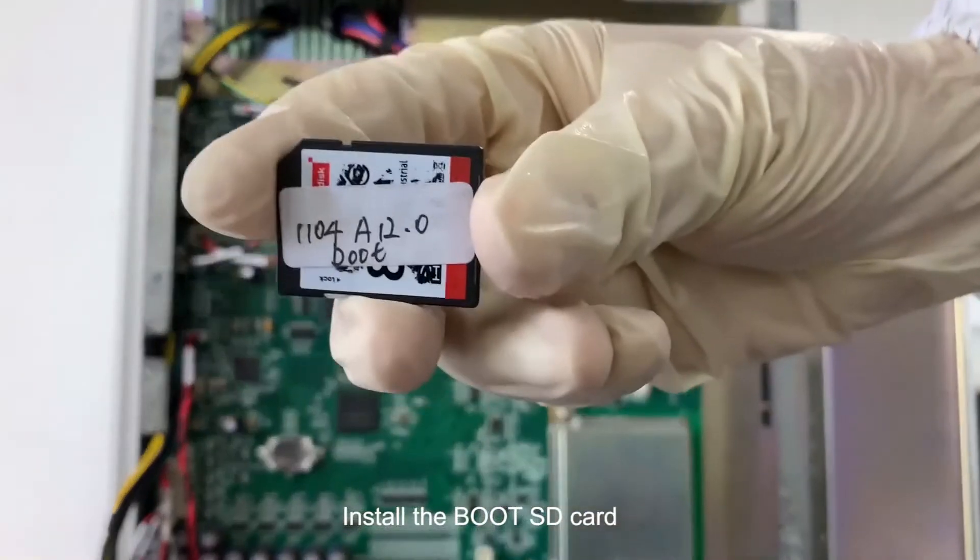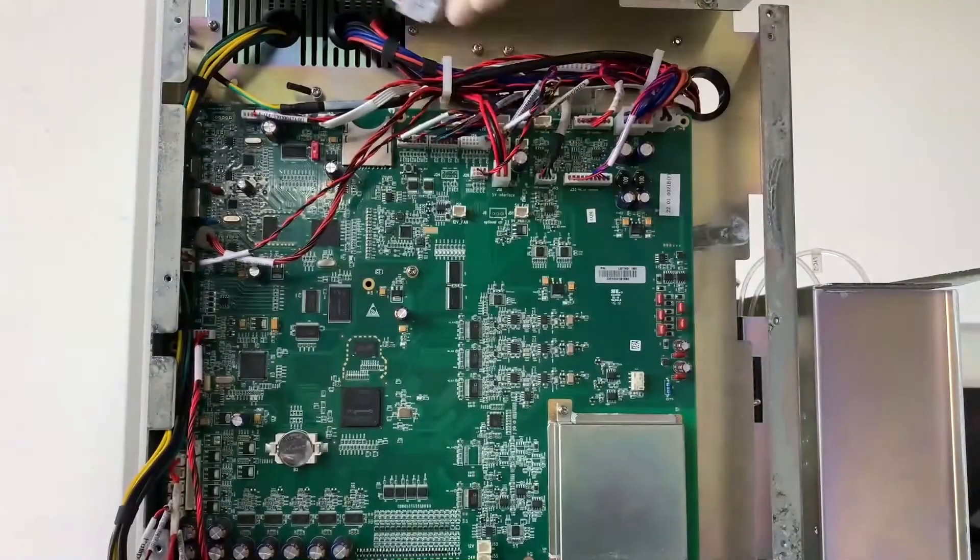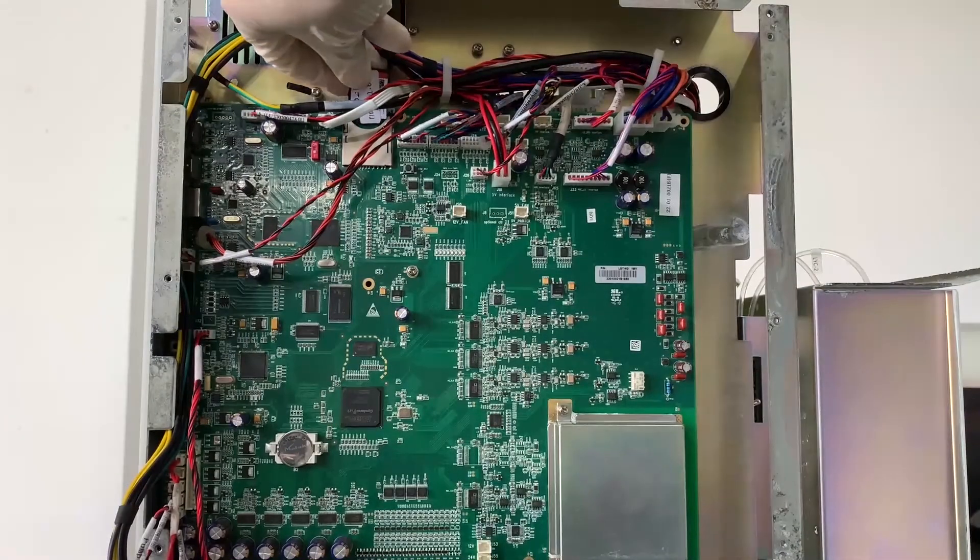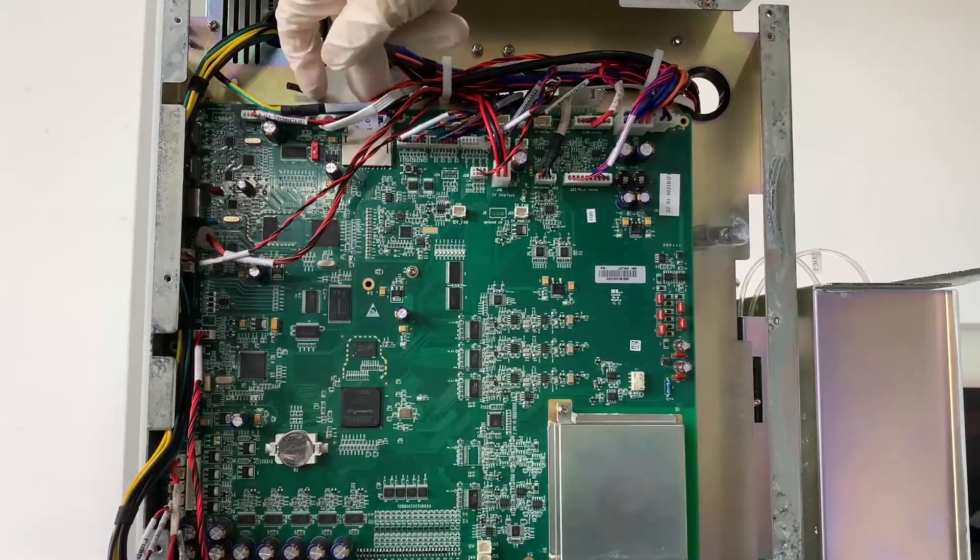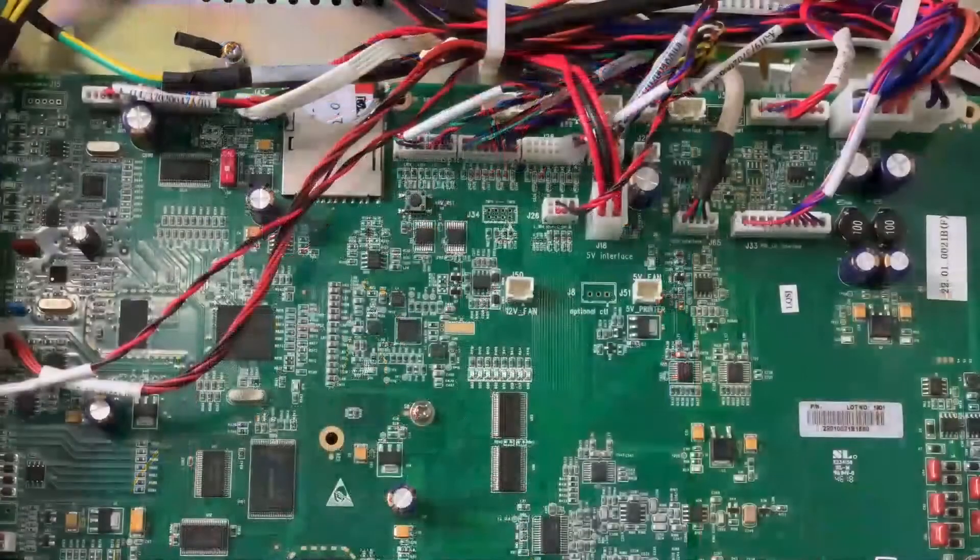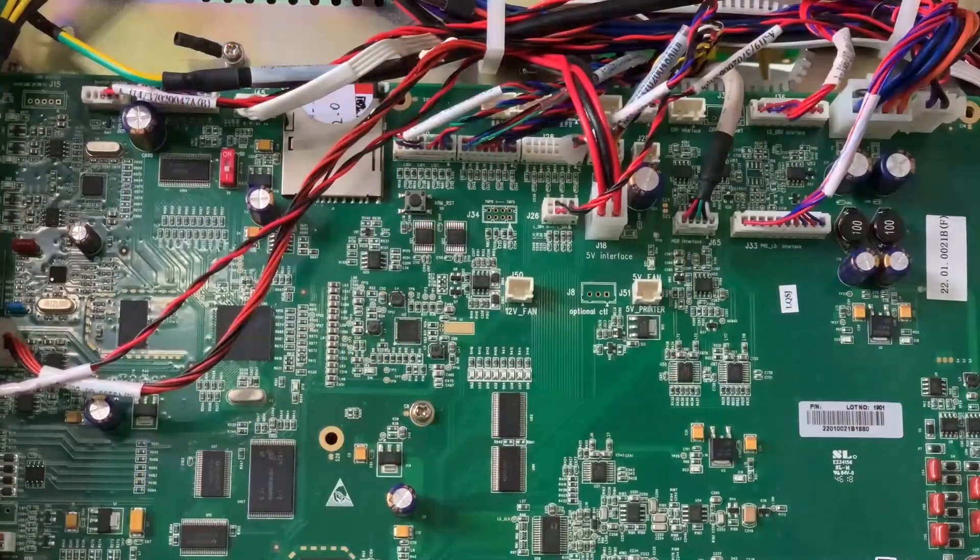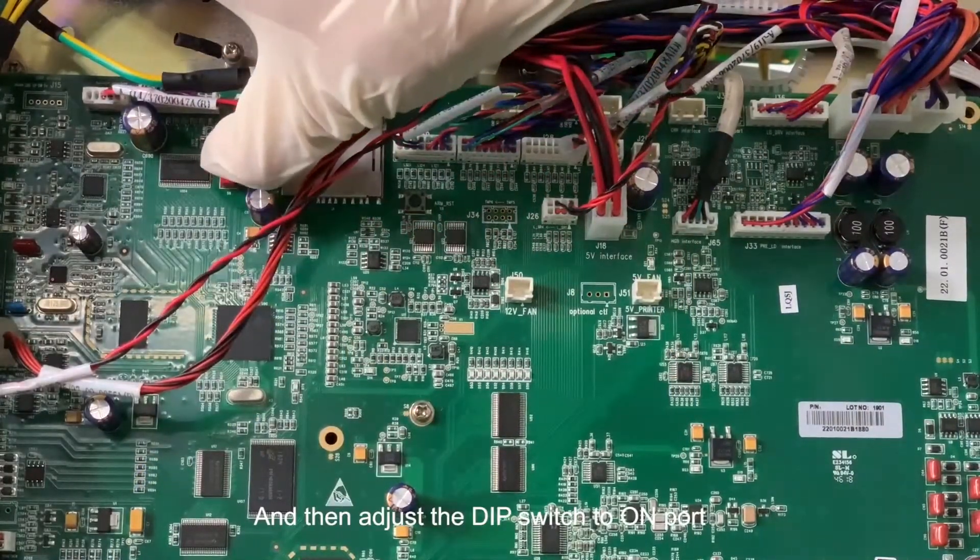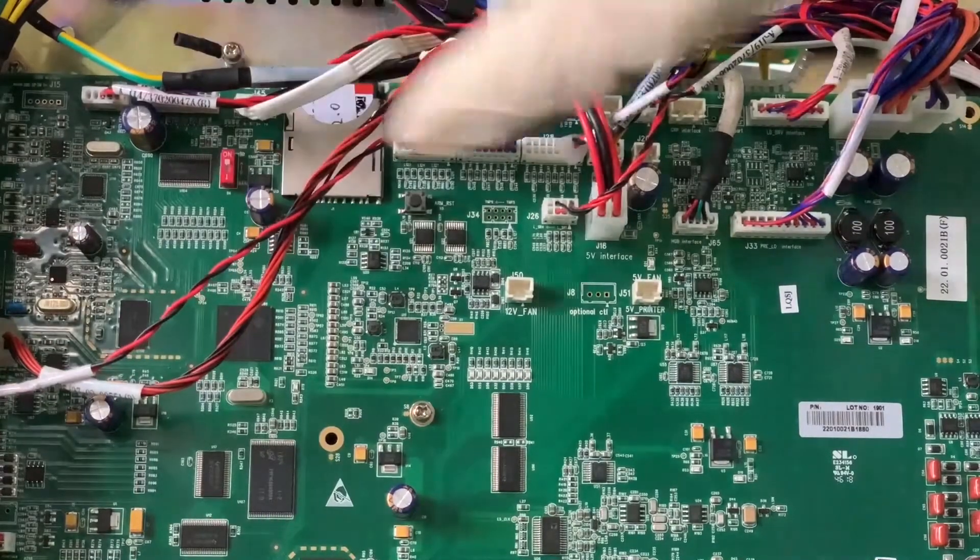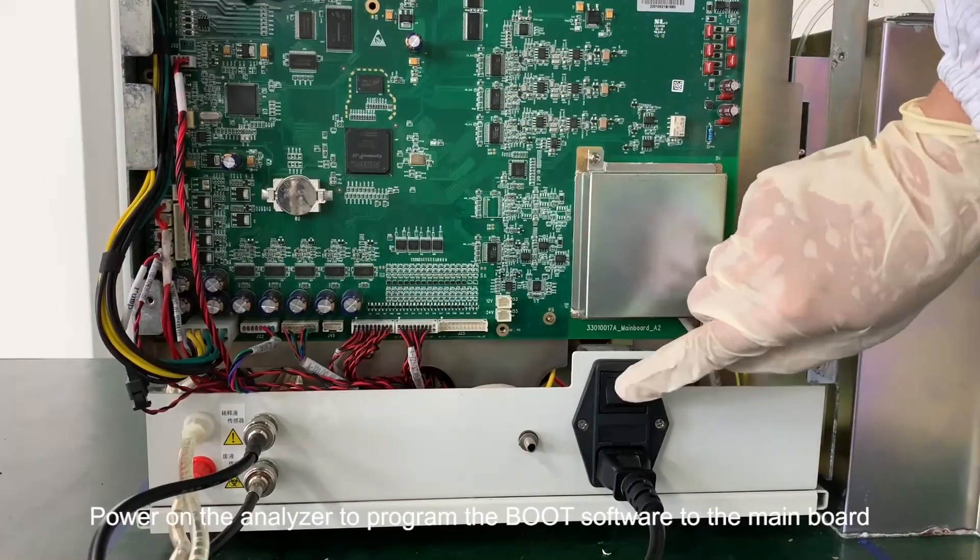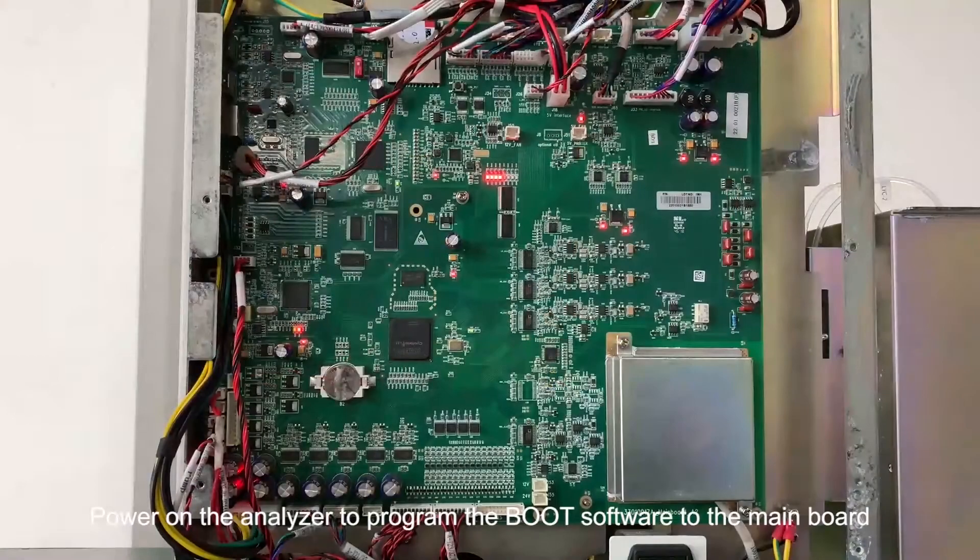Install the boot SD card. Then adjust the DIP switch to on port. Power on the analyzer to program the boot software to the main board.